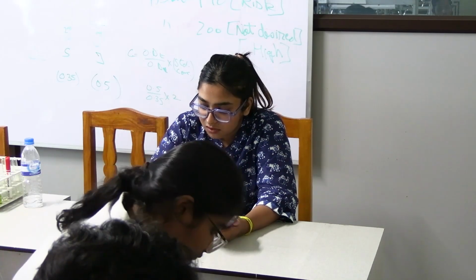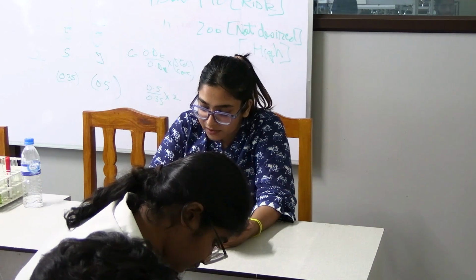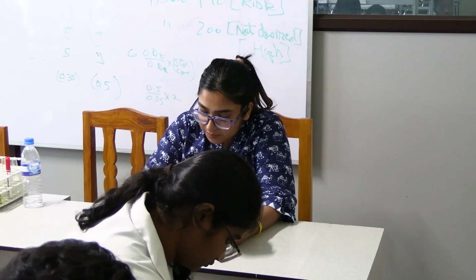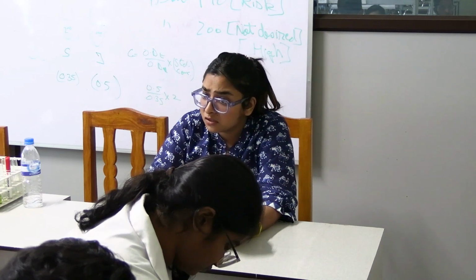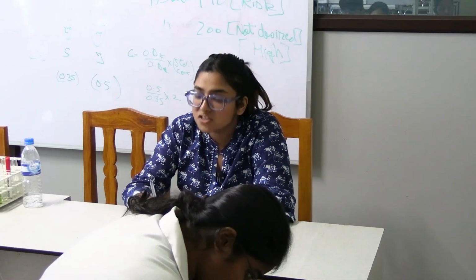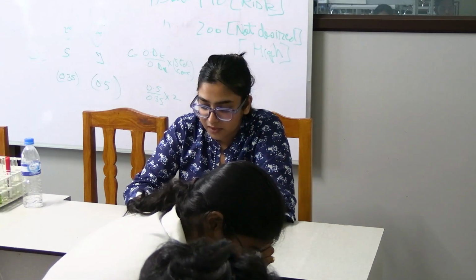This is normal. This is compensated. Compensated what? PCO2 is lowered. That means respiratory alkalosis was here. Okay, and bicarb is normal. That means it is a compensated respiratory alkalosis. Understood or not? This is a case of compensated respiratory alkalosis. Done? Understood? Okay.